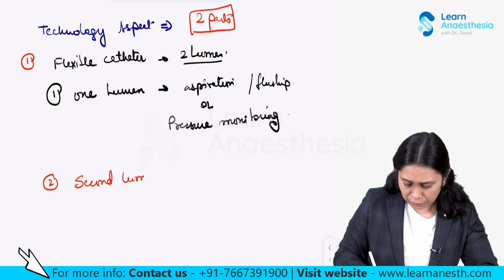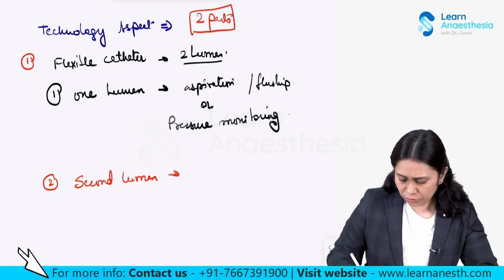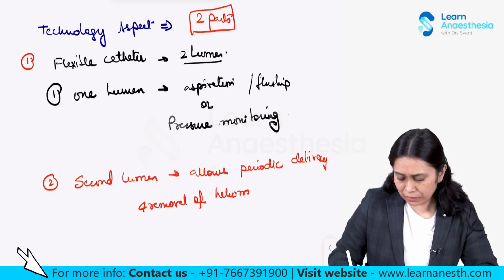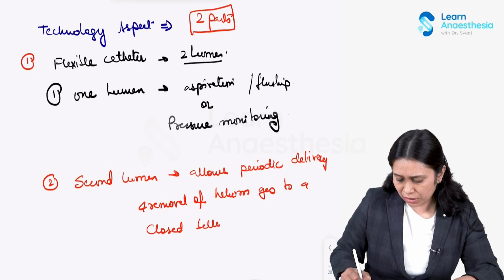Now this lumen permits the periodic delivery and removal of helium gas to a closed balloon which is attached to the lumen.